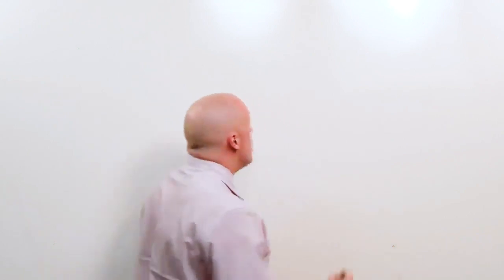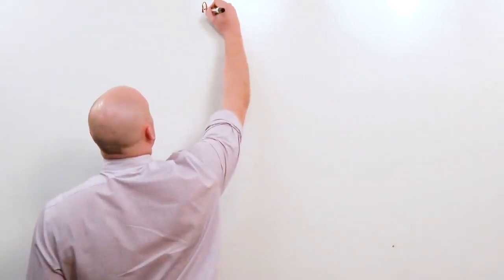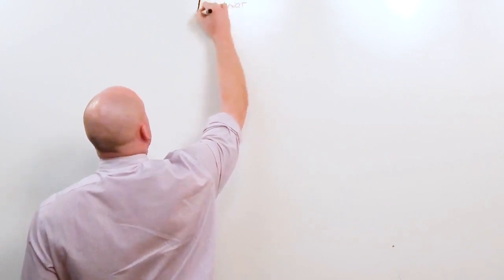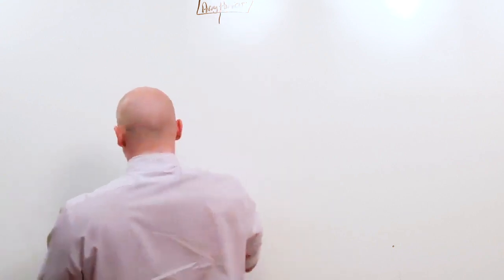So as you go through this video, I want you to also look in your notes where we have typical presentations of what an EKG will look like for each of the different arrhythmias. Pattern recognition is key. Let's go through arrhythmias. Arrhythmias, of course, are going to be diagnosed based on an EKG.